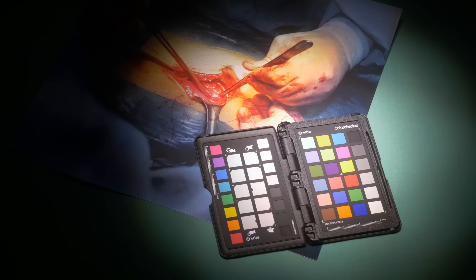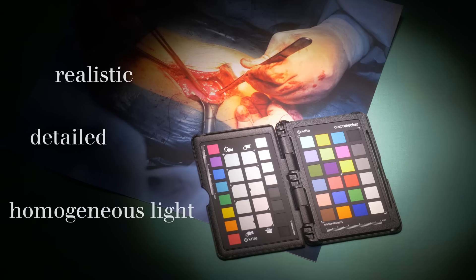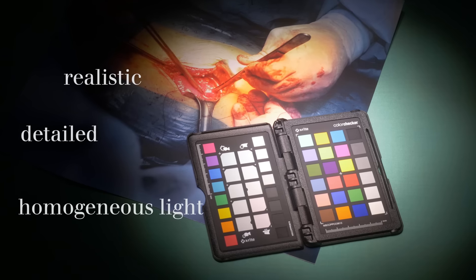With its high color rendering index, the Polaris produces a realistic, detailed, consistently lit image of the surgical area and a natural representation of the tissue down to its finest textures.